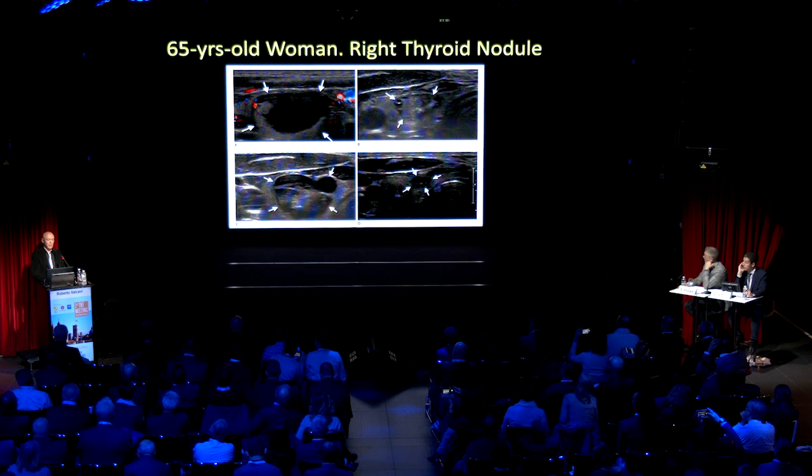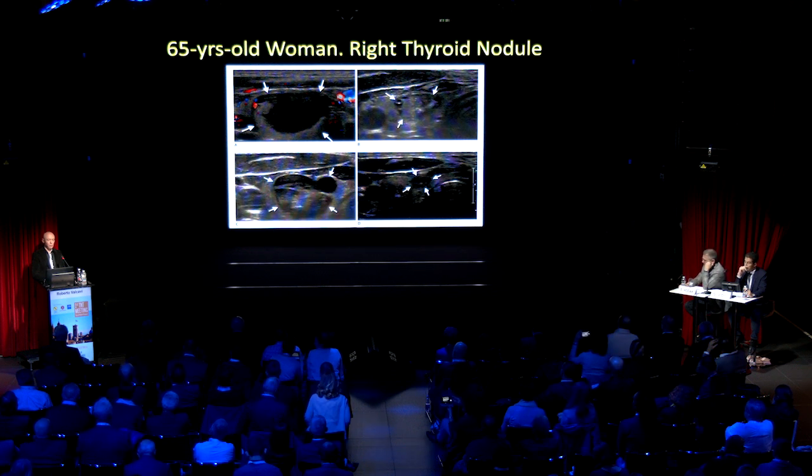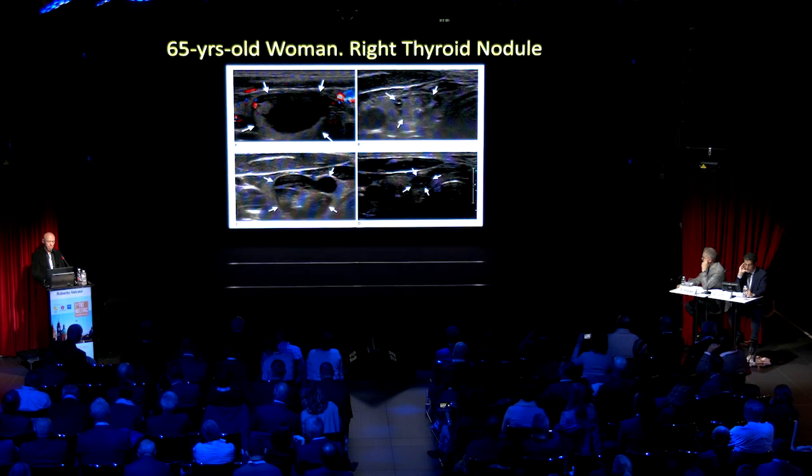In this case, in the first instance, panel A, a mostly cystic lesion, ethanol ablation was performed, but after 3 years, the lesion recurred, and the patient was simply treated with radiofrequency successfully, as you may see in panel D.